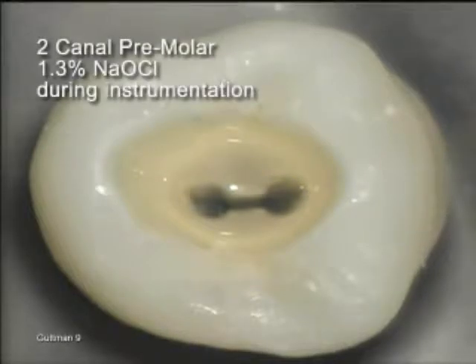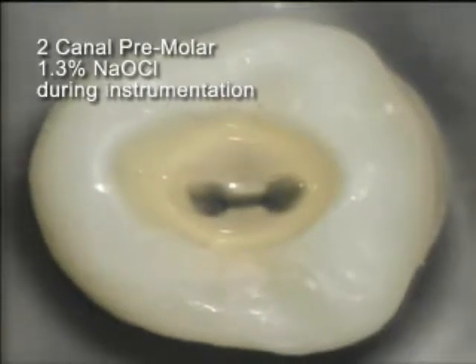This two-canaled premolar was fully instrumented with ProTaper instruments. 1.3% sodium hypochlorite was used throughout the instrumentation process.